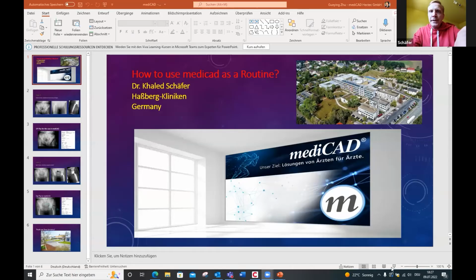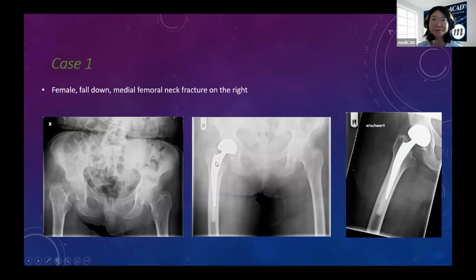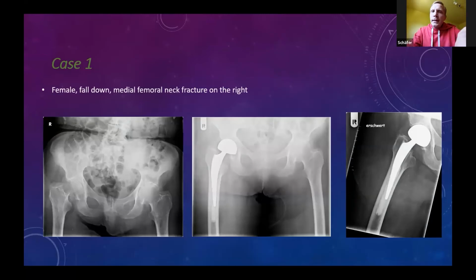I would present two practical cases, the routine every day also in Germany in my hospital. The first case is a woman, 95 years old.